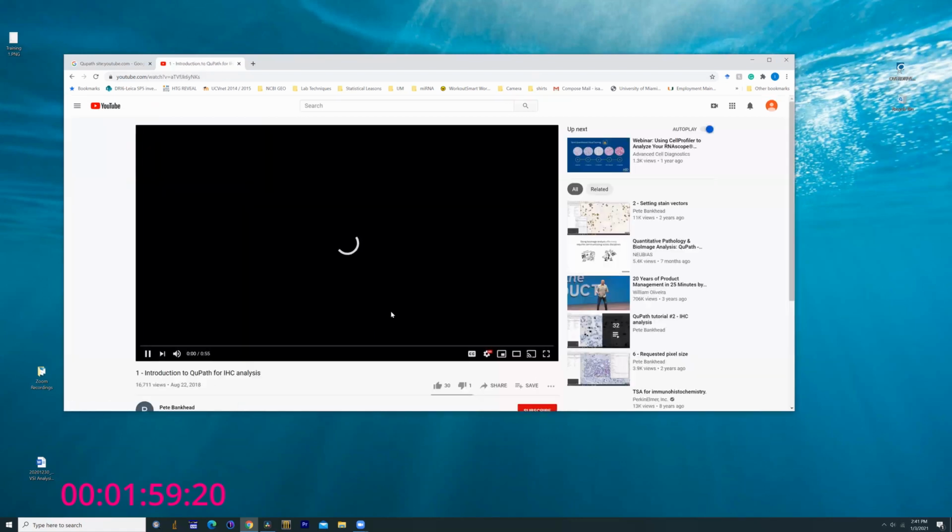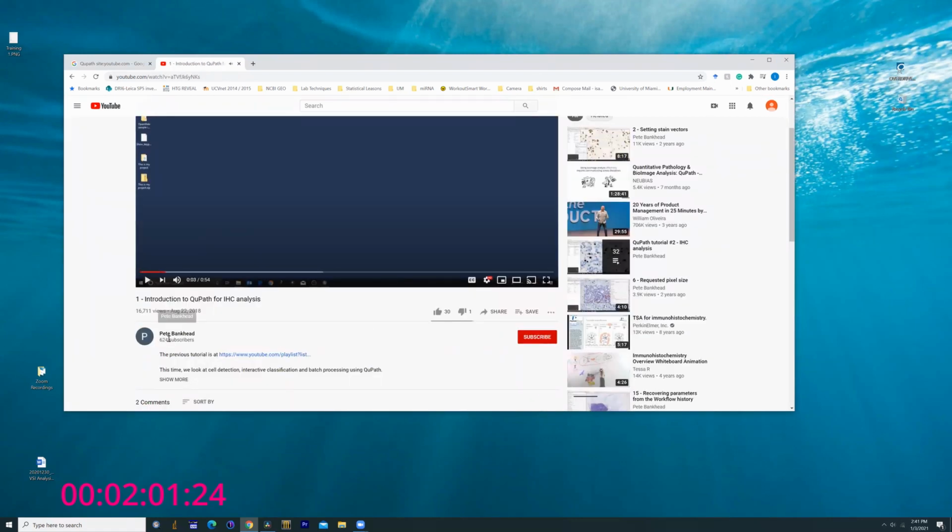And there are links buried within each of these that will put you in contact with the reference material and the actual software and so forth. Anyway, really available, very nice. And the guy has a rather pleasant British accent, probably a lot more concise and refined than my own. But anyway, it's definitely worth a look, especially if you have any questions beyond today's talk.